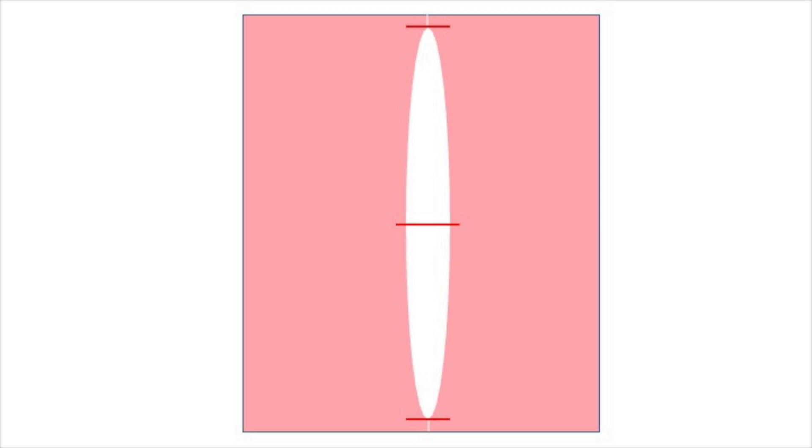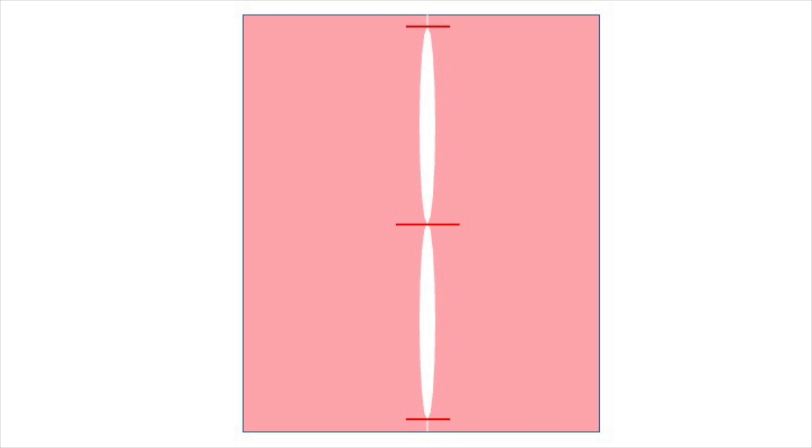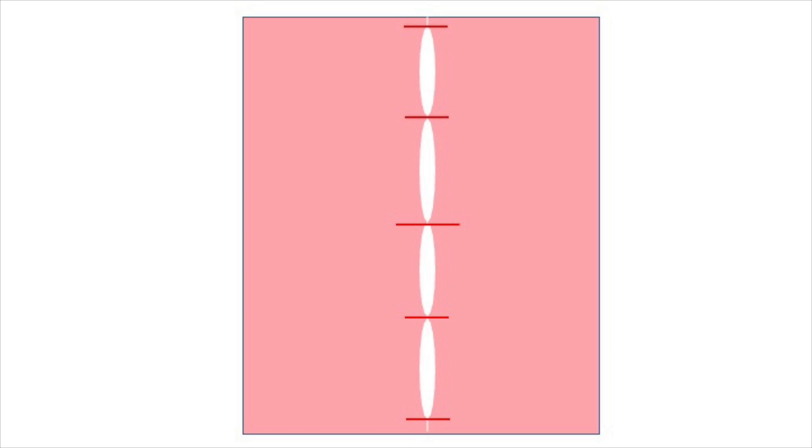Next, place the suture in the middle of the incision. When this knot is tied, it will close the center and show you approximately how many more sutures you need to place in order to close the incision properly without creating bunching skin on either side.